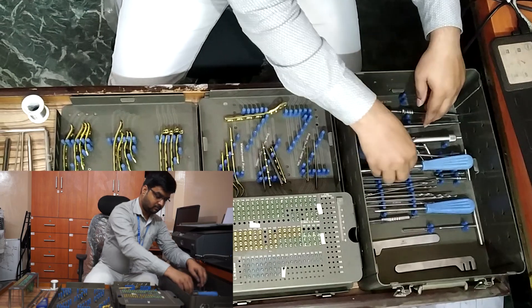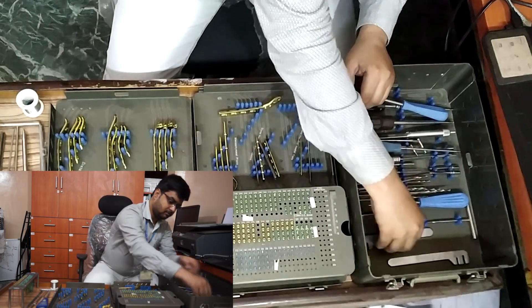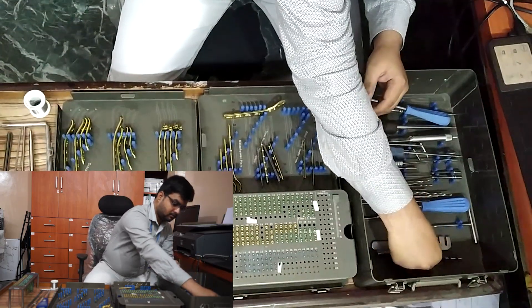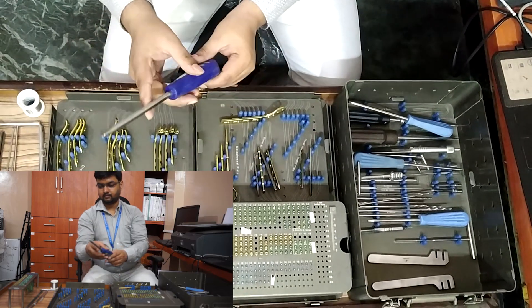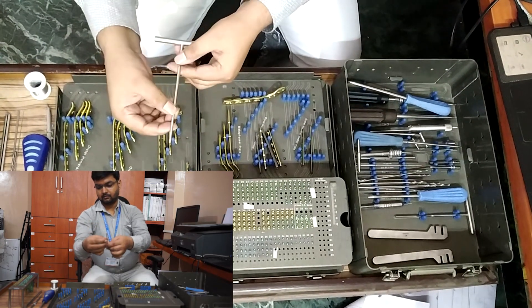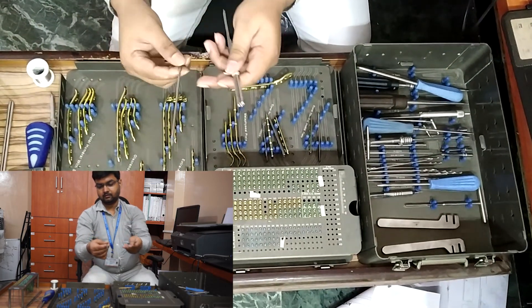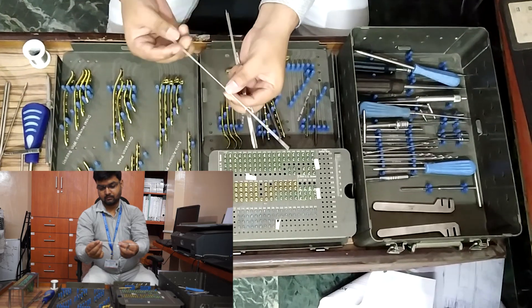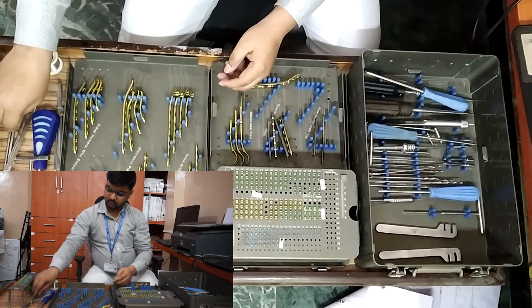Bone tap 3.5 mm, one piece. Plate bender in pair, small. CC screwdriver — cannulated cancellous screw screwdriver — 3.5 mm, 150 mm length, one piece. CC bone tap, one piece. CC drill bit 3.2 mm, 6-inch length, two pieces. Guide pin 1.2 mm, 9-inch length, plain and threaded, four pieces each. Measuring device.